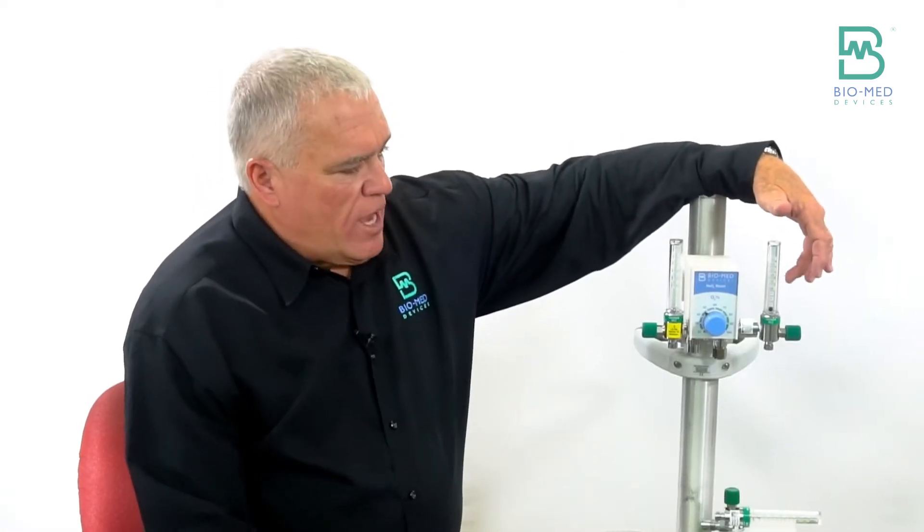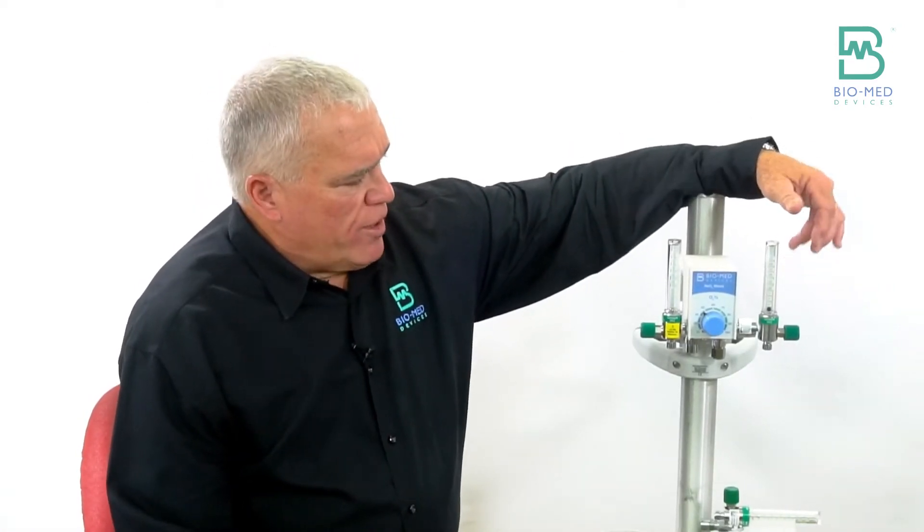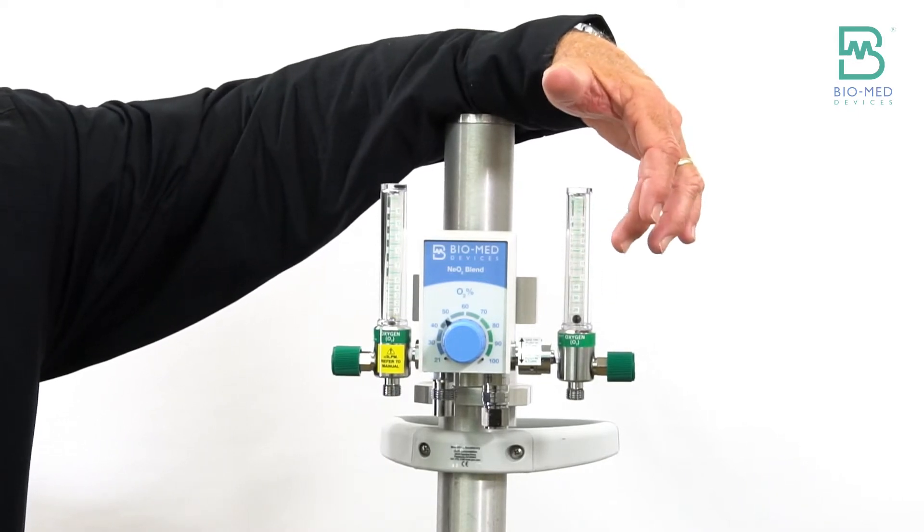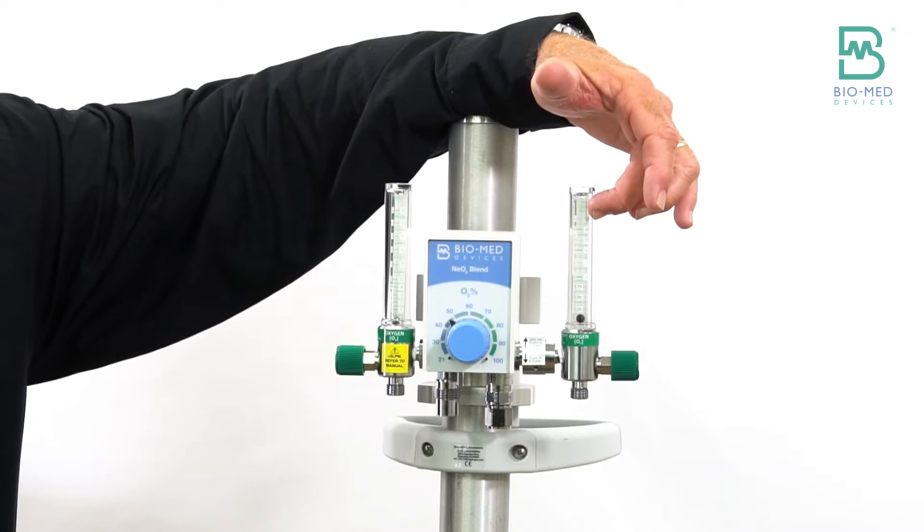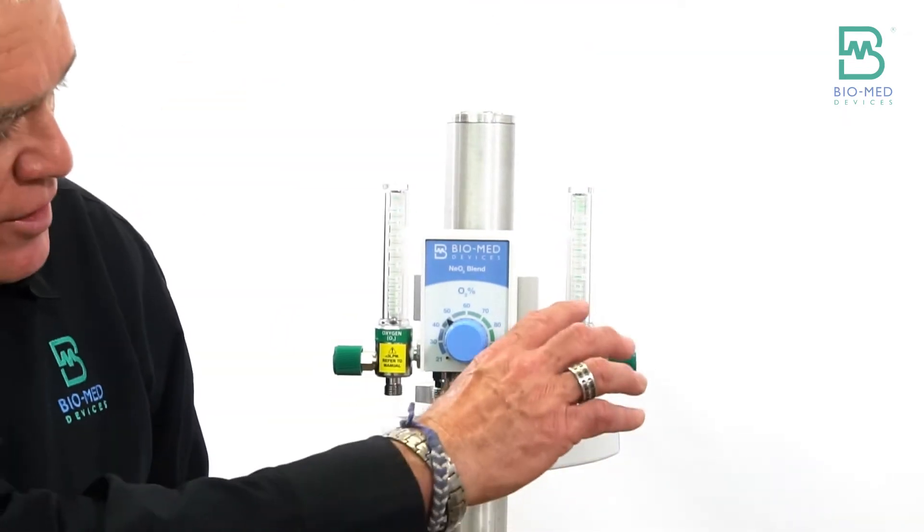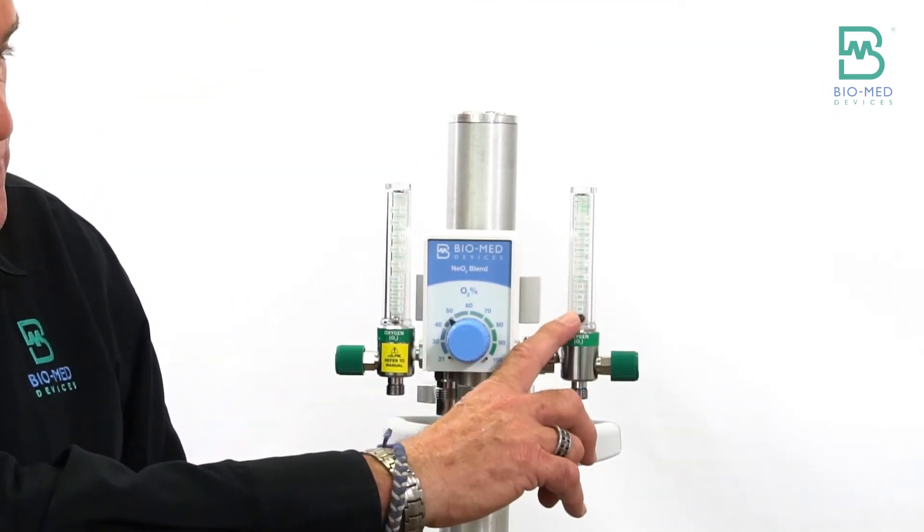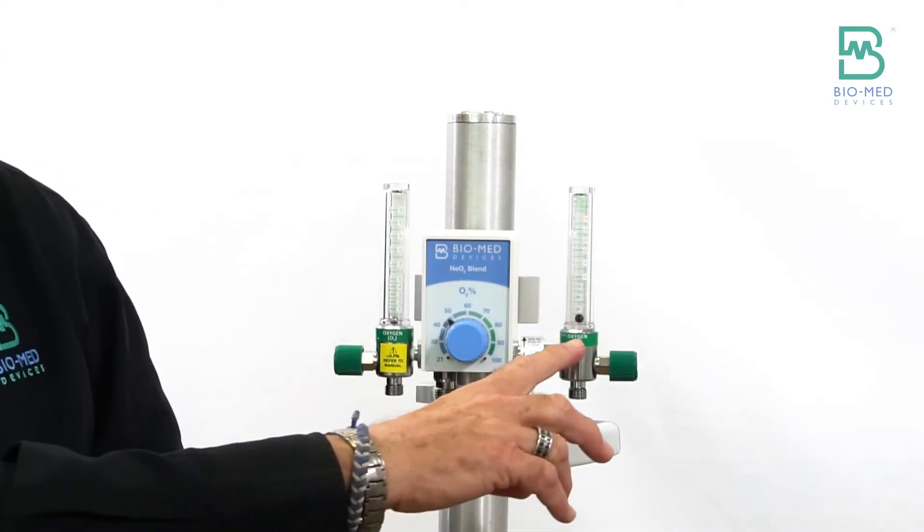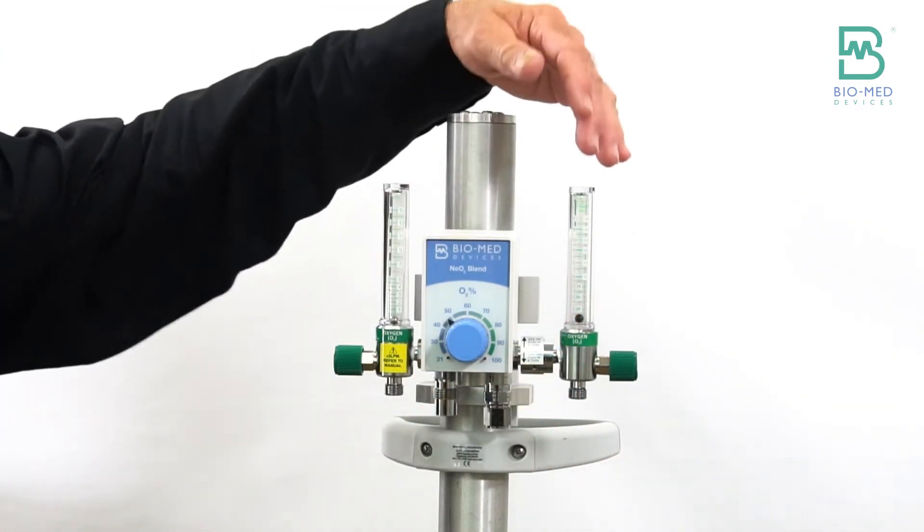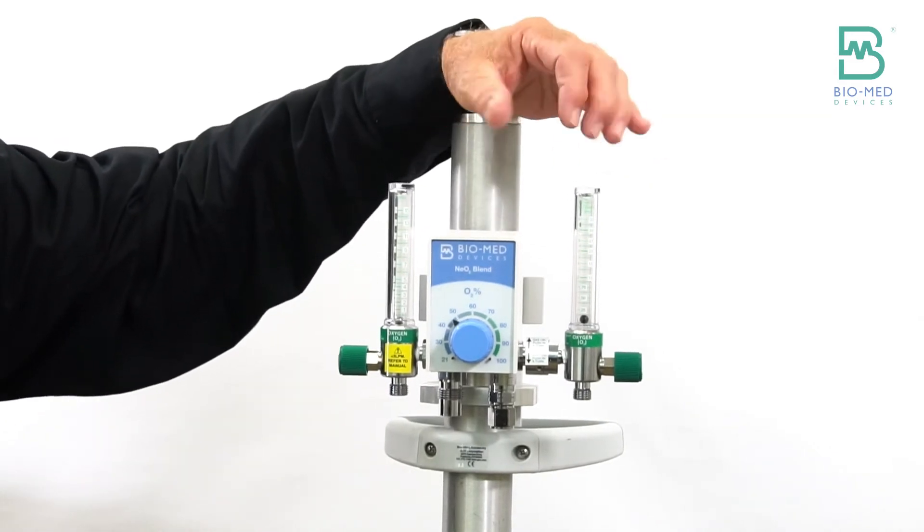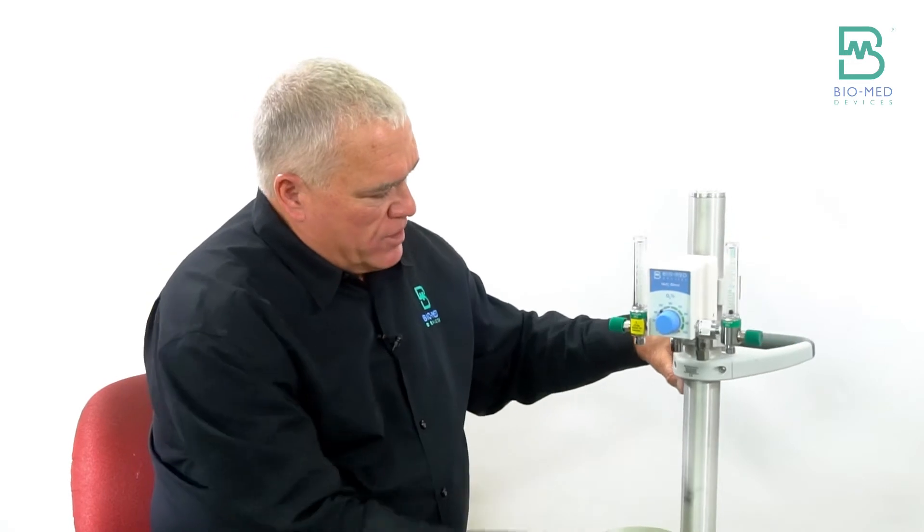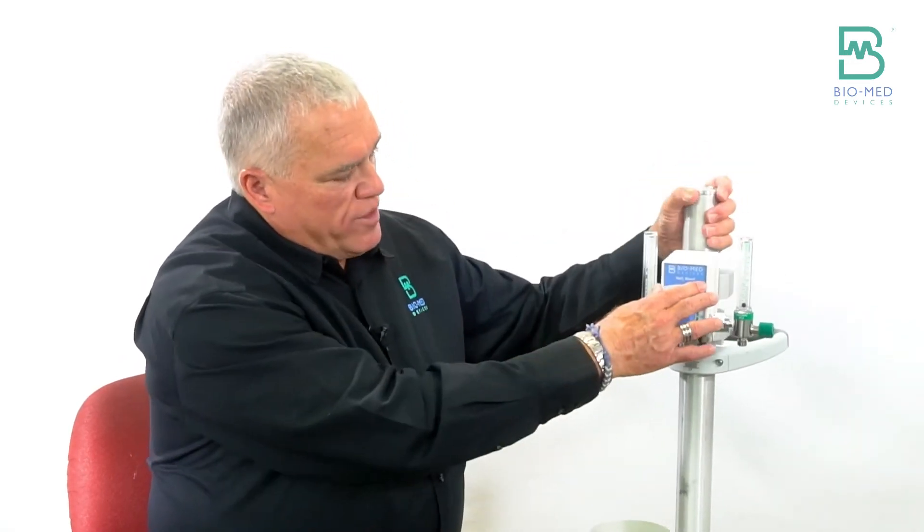On this side we actually have three different options. You can go with zero to fifteen liter, zero to three and a half, which is on here now. You can still dial in the accuracies down to say an eighth of a liter if need be. And then we have a zero to one liter for people that really want to be accurate with those low flows.